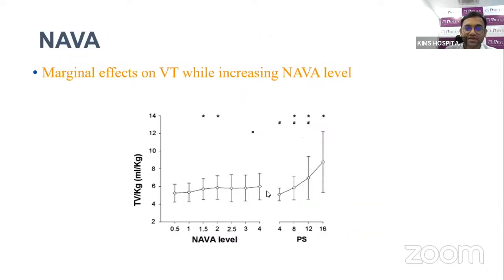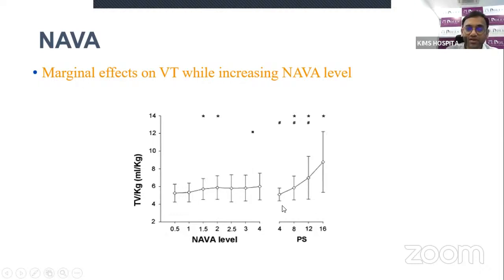So this is the way we can see that in routine pressure support ventilation, if you increase the pressure support, the tidal volume will increase. It's not volume-guaranteed ventilation, I'm just talking about normal pressure support. If you increase the pressures, the tidal volume will increase, and there is no check in the case of a routine.